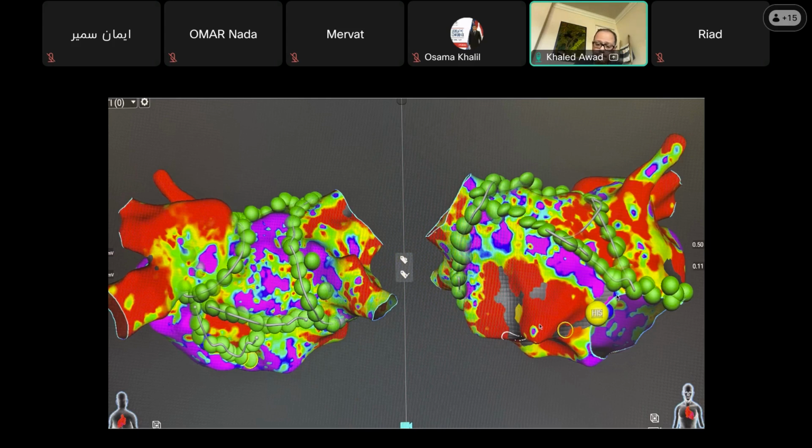We're done. But generally speaking, if someone is not young and it's not an isolated arrhythmia, especially if it's a macro reentry, any macro reentry in the left atrium, you're going to have to isolate the veins. That's number one. Before you even try to terminate, before you do anything, isolate the veins first and then do your linear lesion set. Why? Because you need to connect the linear lesion set to two anatomic barriers.